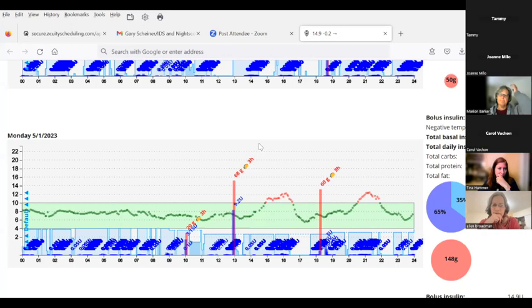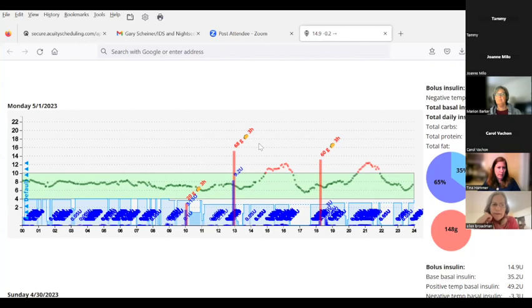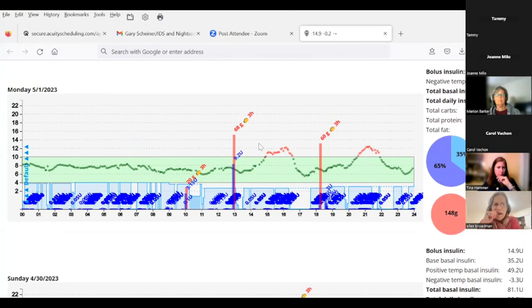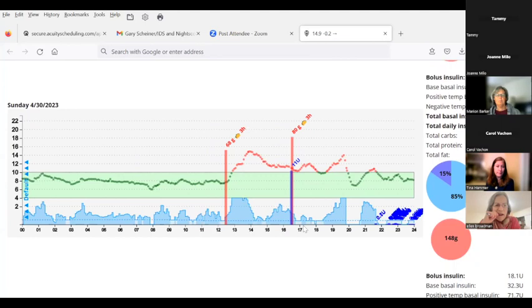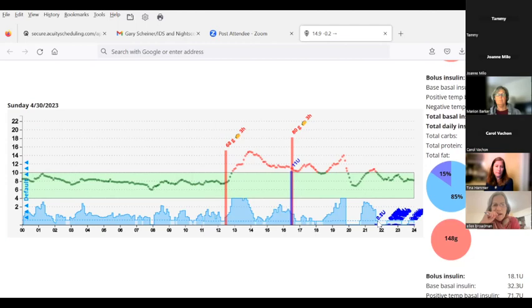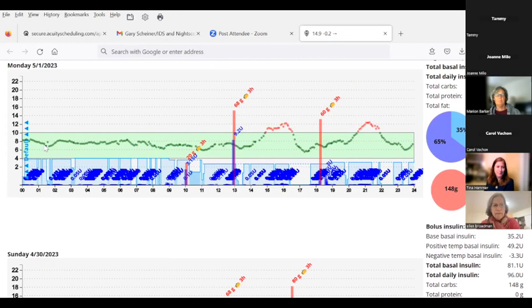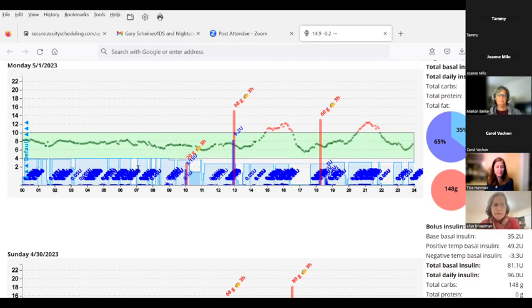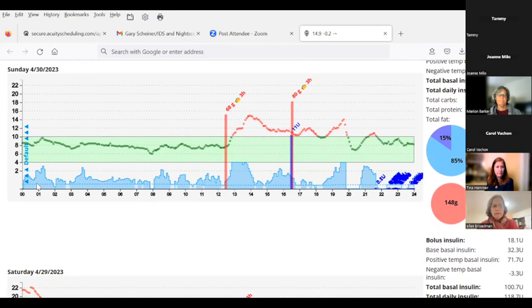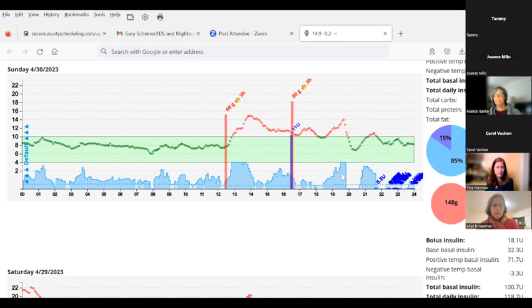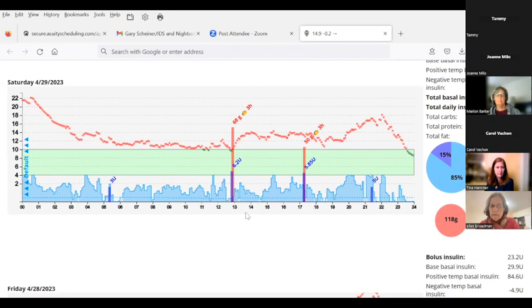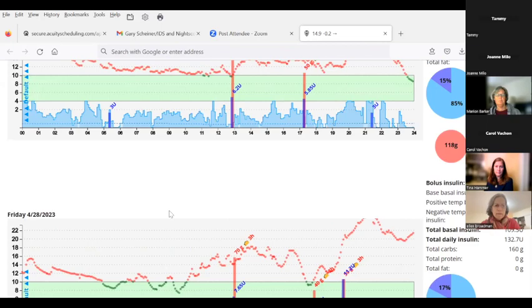You're not seeing automated correction boluses on Sunday because he switched from temp basal branch to autobolus branch at 10 o'clock Sunday night. I did that intentionally. If you're using the autobolus branch, you're going to be getting either your normal basal or zero. It shows in white when it cuts down to zero, and it's showing autoboluses to fix highs. When he's in temp basal branch on loop, it's constantly adjusting the basal delivery.